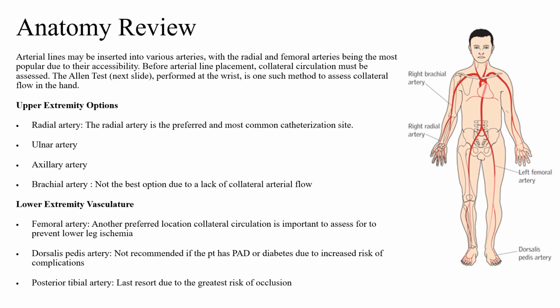And we'll talk about risks associated with these things too, but clots are a huge risk, and so we want to be very mindful of the size artery that we're using, where we're going, if the patient has any other comorbidities, things like peripheral artery disease or diabetes that might prevent us from picking a site. So we have to take all of this into consideration.